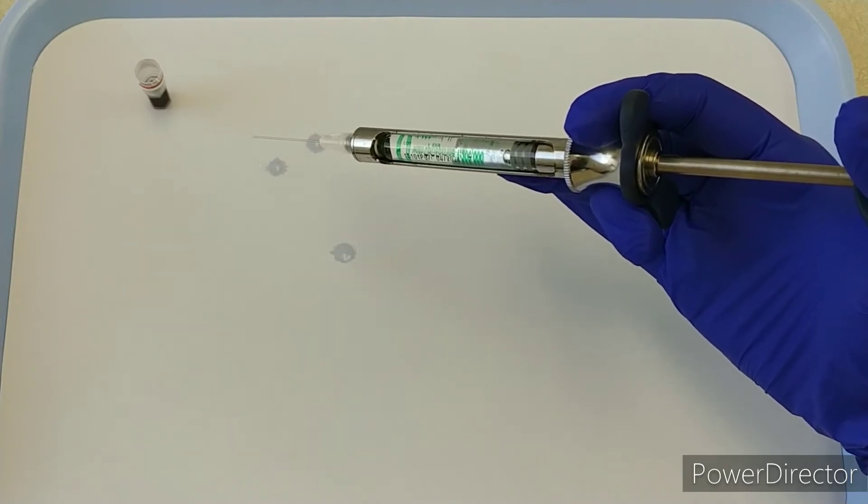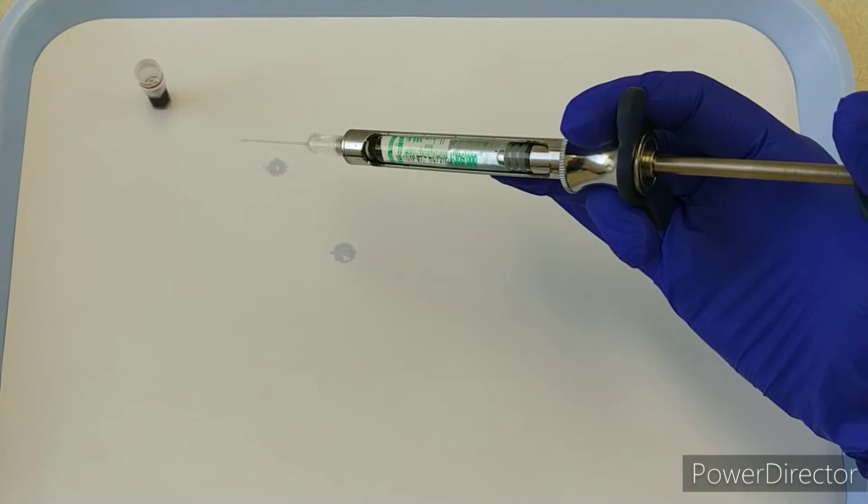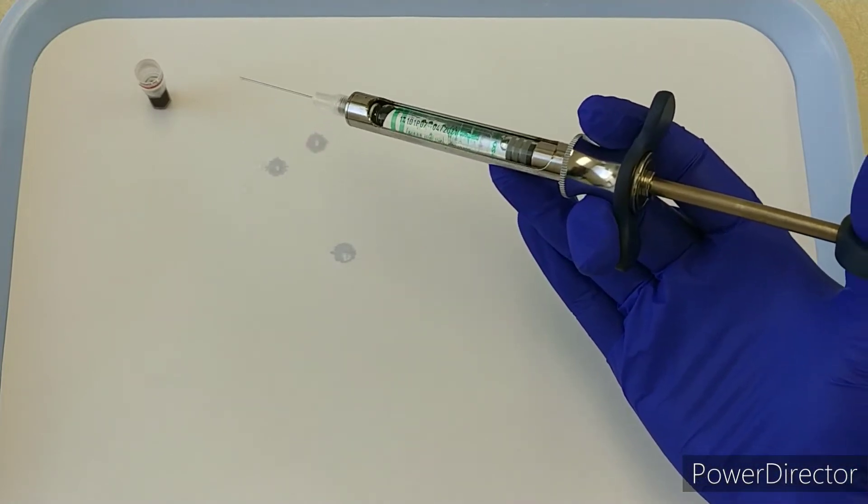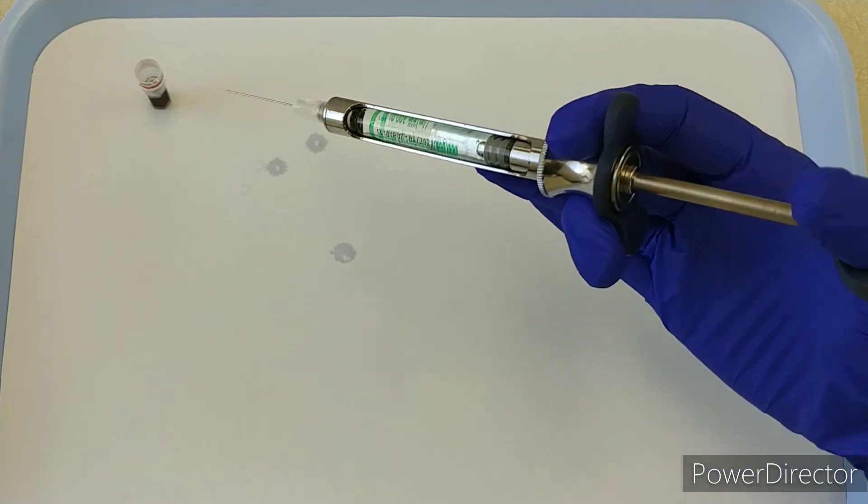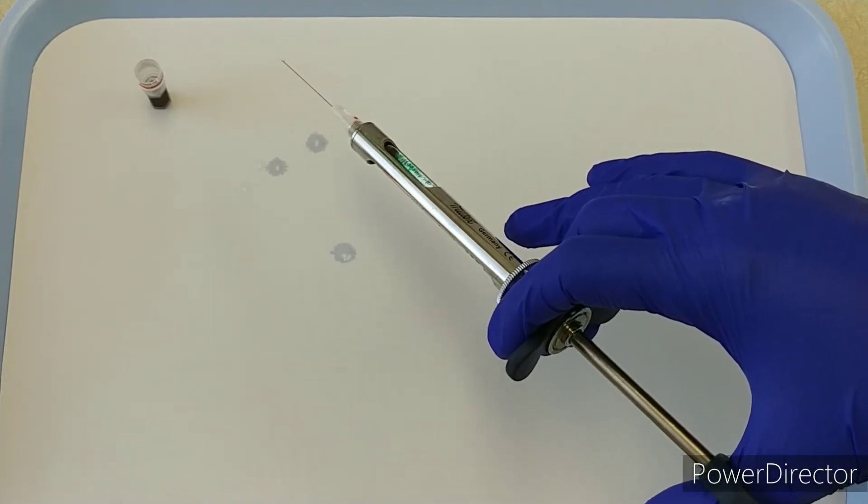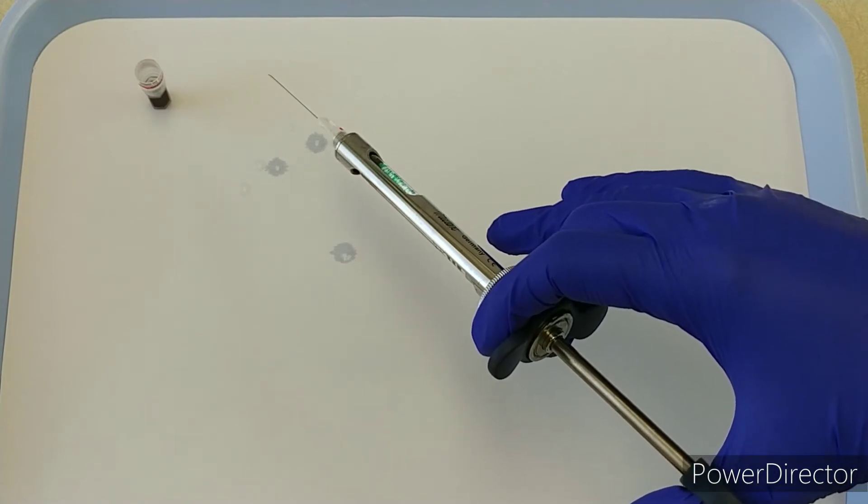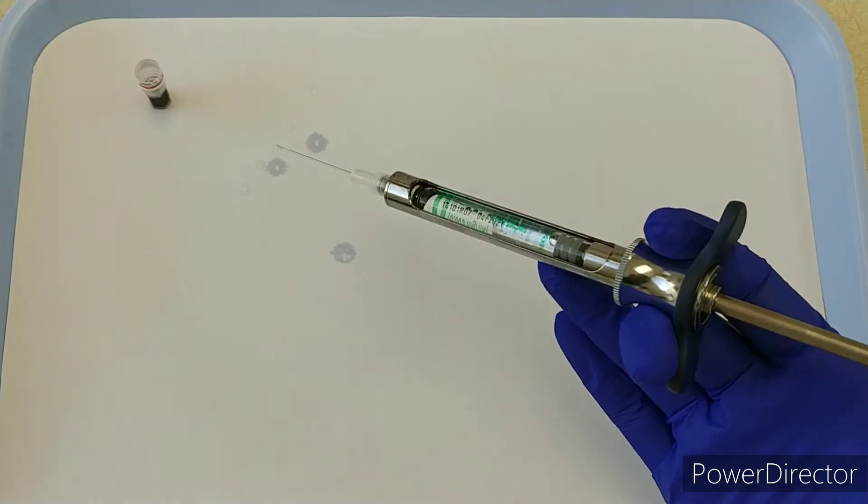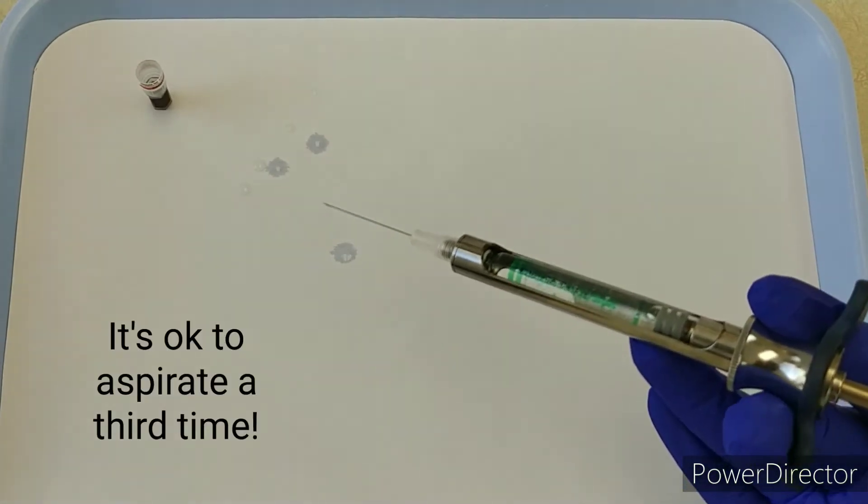Sometimes I'll see students rotating to the point where they're not really able to see their big window. That's okay if that happens—just rotate back till you can and then aspirate again. It's okay to do more than two aspirations, so that's the solution for that.